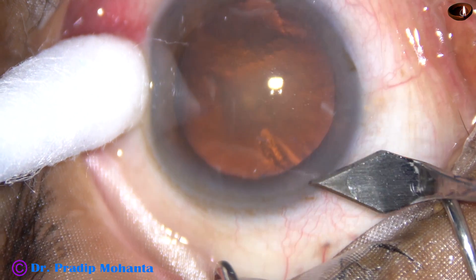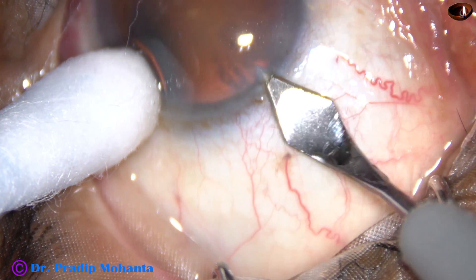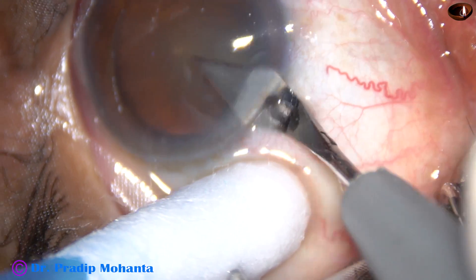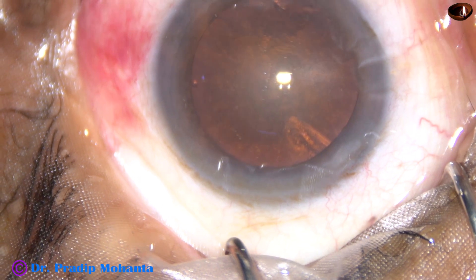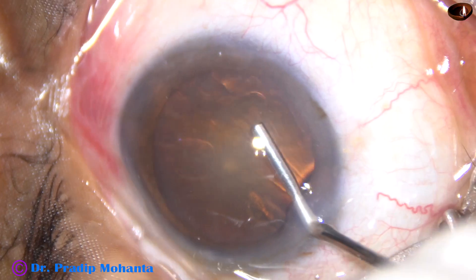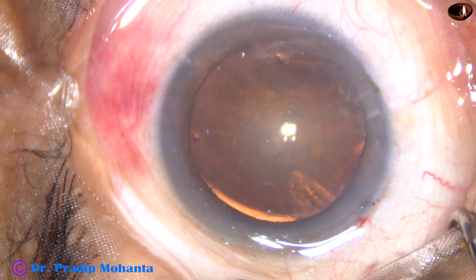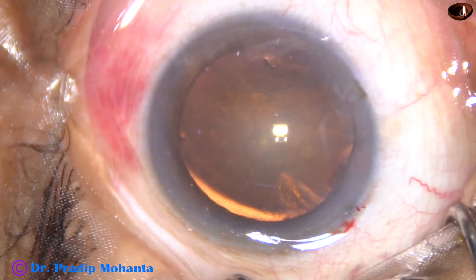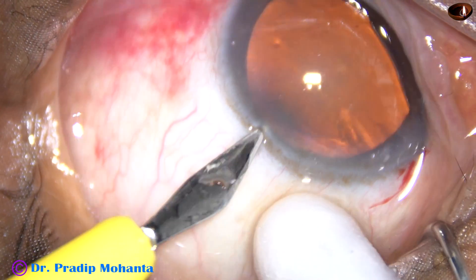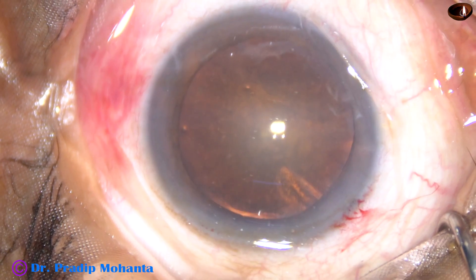This is the main incision with a 2.8 mm keratome on the posterior aspect of the limbus. A cotton-tipped Johnson bar is being used to fix the eyeball. 2% hydroxypropylmethylcellulose is being injected into the anterior chamber. The patient is under topical anesthesia — just proparacaine eye drop has been applied on the ocular surface.